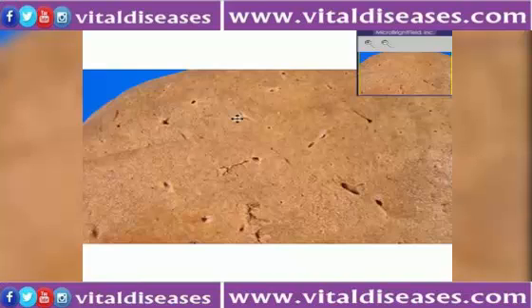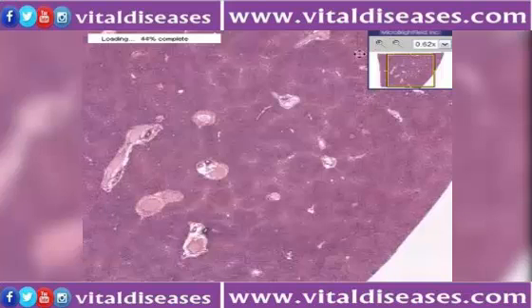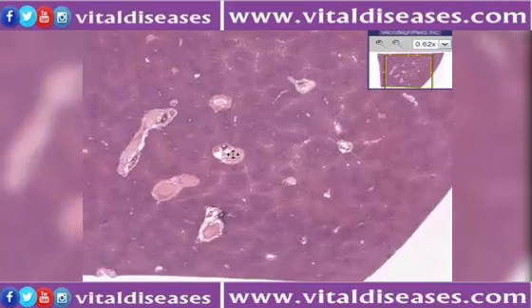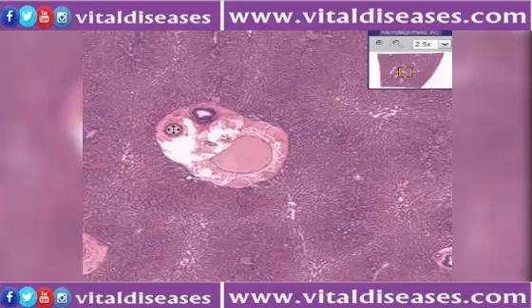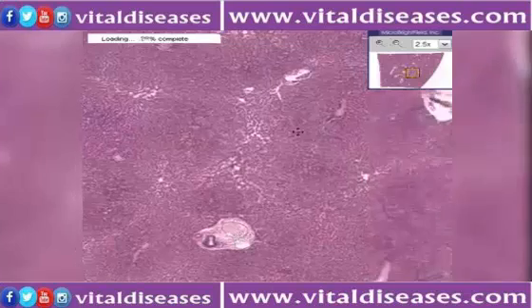So take a very good look at this cut surface of a liver. Look at it up close, because right now we're going to jump from gross to microscopic. And that's basically the same thing we're looking at. Once again, the big holes that have connective tissue around them, like this one, are much more likely to be portal veins because they're part of the portal triads. Because you can see an artery here, a bile duct here, and the big vein here. And here's another portal triad because you can see all three.